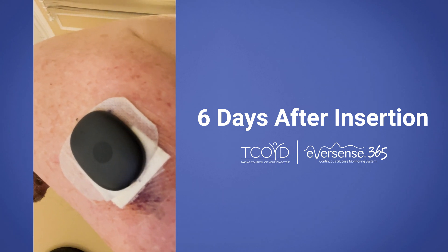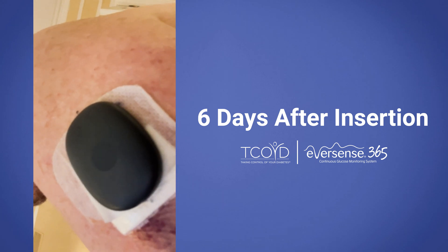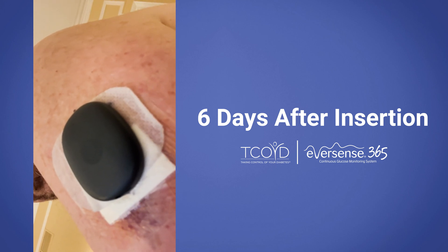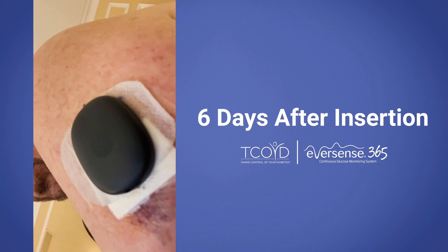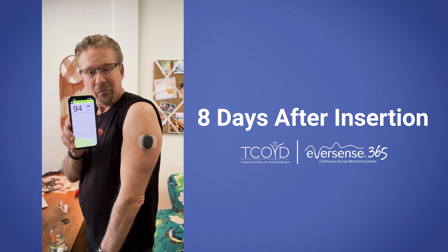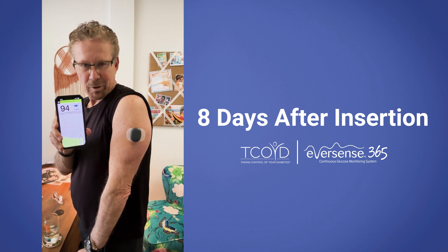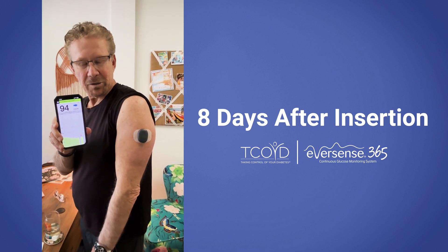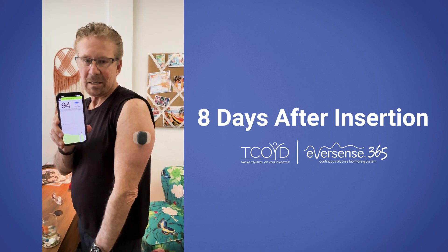Alrighty, day six. So far, bandage is not coming off. No pain or soreness. Everything doing well. And of course, the CGM, ever since insertion, is working well, showing me blood sugars every five minutes. Hello folks. Post-insertion day number eight. As you can see, looks pretty good. I've been getting readings the whole eight days, but now I got the bandage off. And I guess I'll see you in about a year when I need my next new 365. Bye.